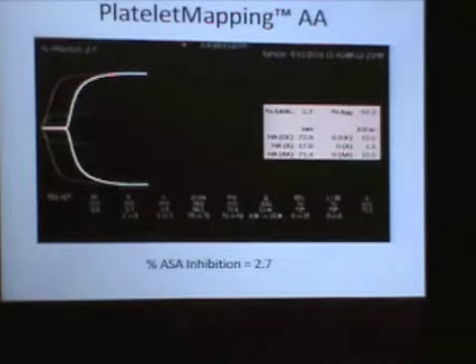You're exactly right. Or that patient could have been on a statin, where the Plavix isn't working, and then you may have to up his dose of aspirin. Okay, but post-fracture fixation, this patient's at risk for throwing clots. This is where the orthopedic surgeon will put these patients on Lovenox post-procedure. So now you need to monitor the Lovenox dosing on these patients. Because the Lovenox should lengthen the R out, but is it going to narrow the MA? If it doesn't, then you've got to help these patients with platelet inhibition.